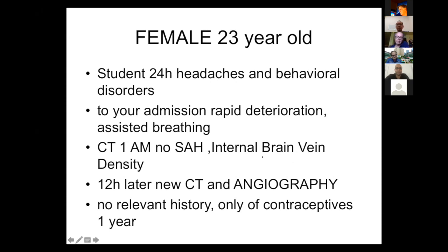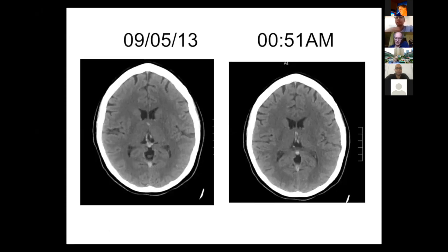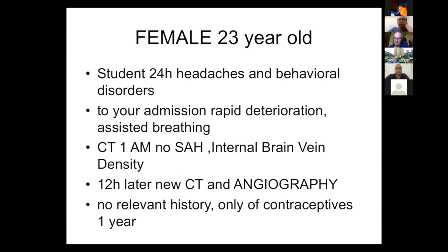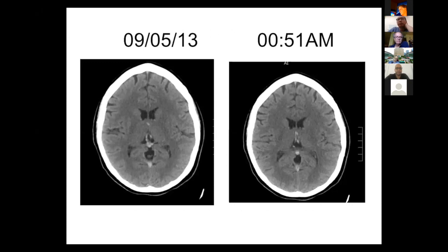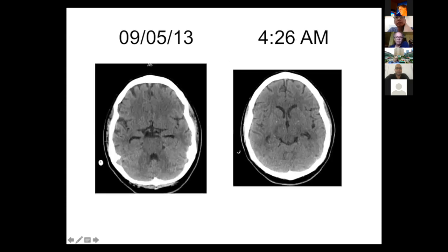The initial CT showed no subarachnoid hemorrhage, only some high density in the internal cerebral vein — but this finding was subtle and not identified in the initial reading. I repeated the scanner at five o'clock in the morning. I also performed an MRI and will show you the images and the evolution.